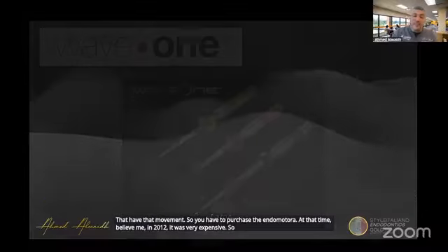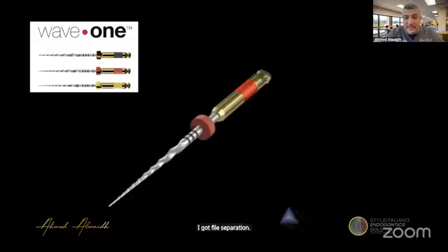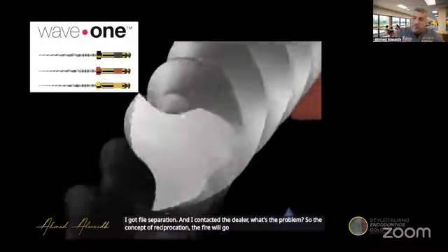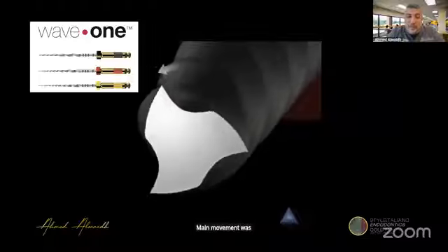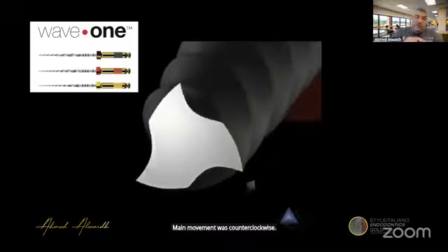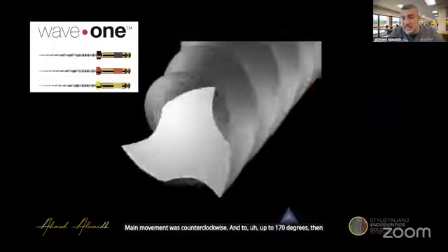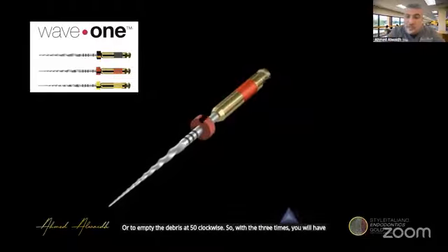From the first case, I was very happy. I got file separation, and I contacted the dealer. What's the problem? The concept of reciprocation is that the file will go back and forth, clockwise and counterclockwise. The main movement was counterclockwise, up to 170 degrees, then clockwise as a release, to empty the debris, at 50 degrees clockwise. So with three times, you will have a complete circle.